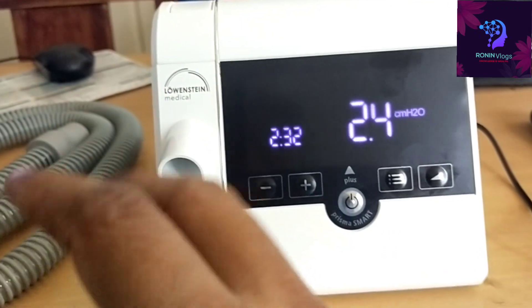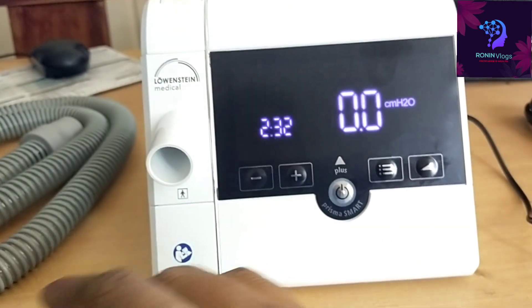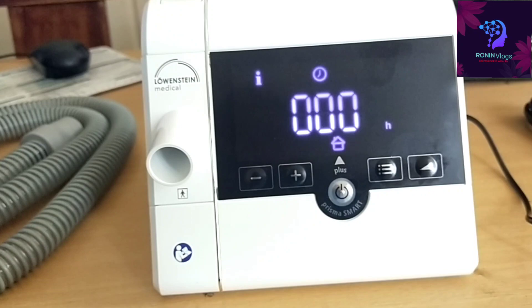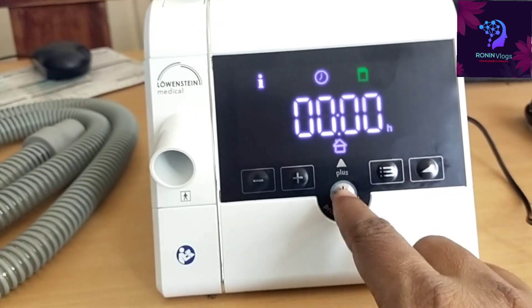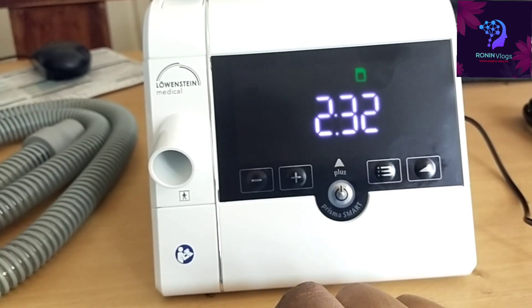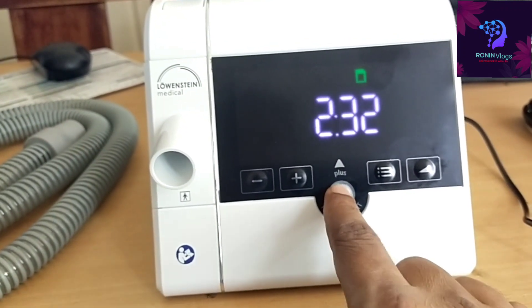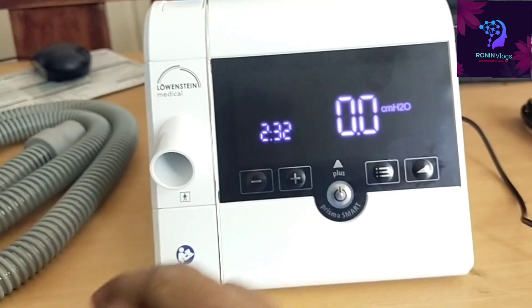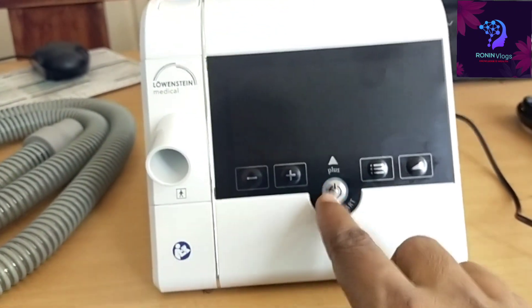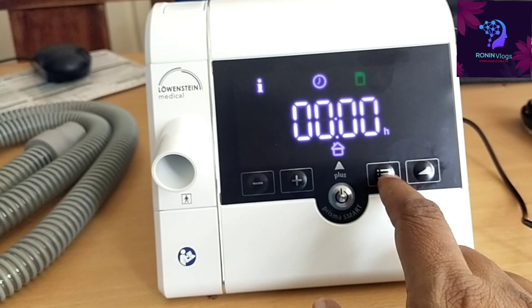Press once more and the machine will automatically start because I already selected the automatic mode. If there is any leakage it will stop. If automatic mode is off, it will continuously work. If automatic mode is on and there is any mask leakage, the machine will automatically turn off.